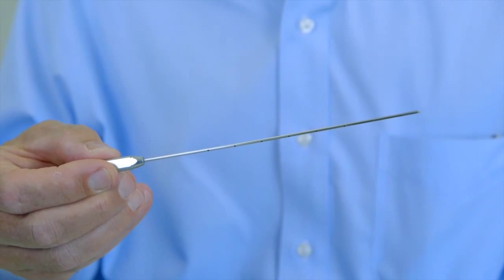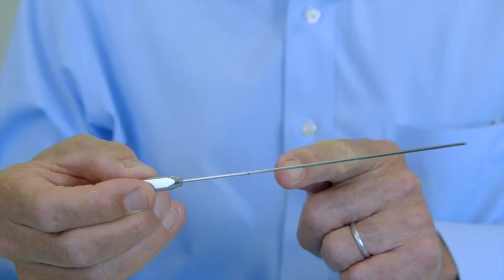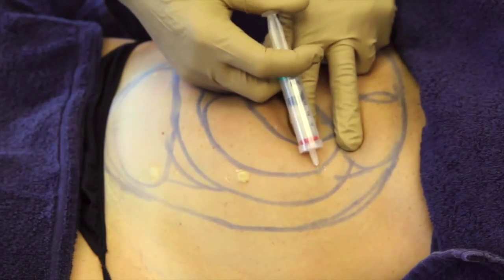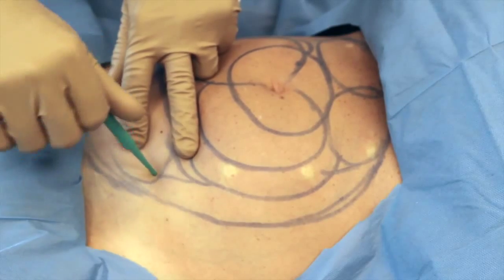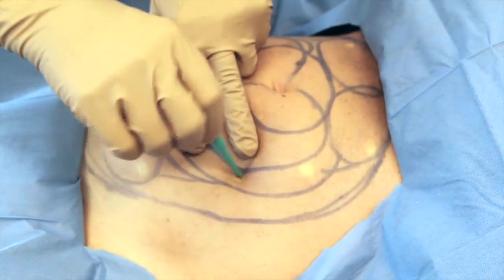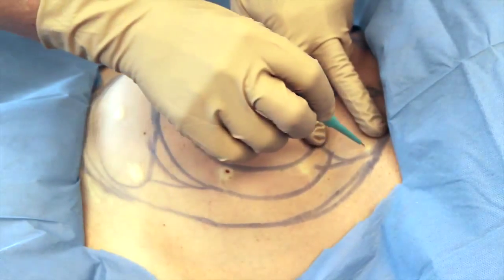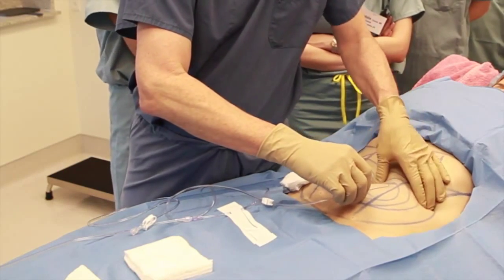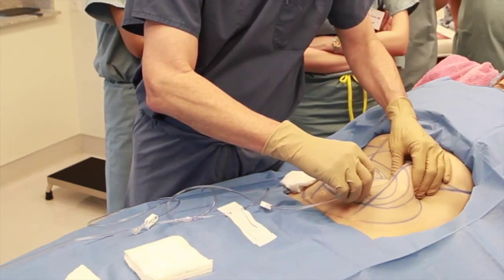The use of a full Monty is the secret to infiltration of a large volume of tumescent anesthesia in a painless fashion. We put little blebs of the tumescent local anesthesia in the skin through which we will place one-millimeter holes using a one-millimeter punch biopsy. These little holes are called adits. A one-millimeter punch virtually leaves no scar, and it allows multiple insertions without traumatizing the dermis and epidermis and avoids post-inflammatory hyperpigmentation.